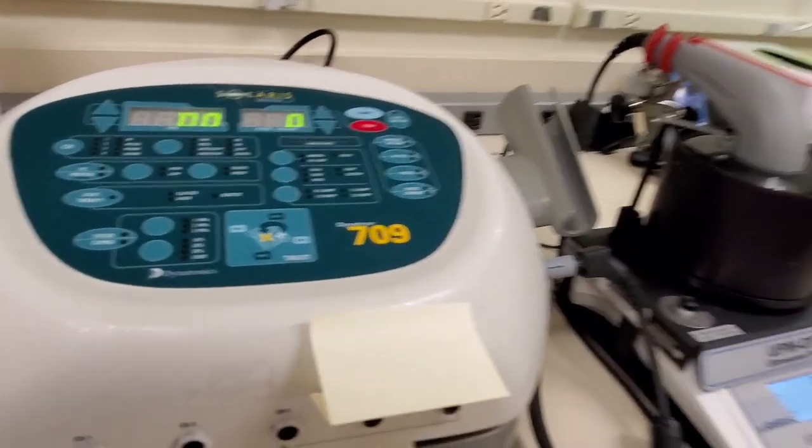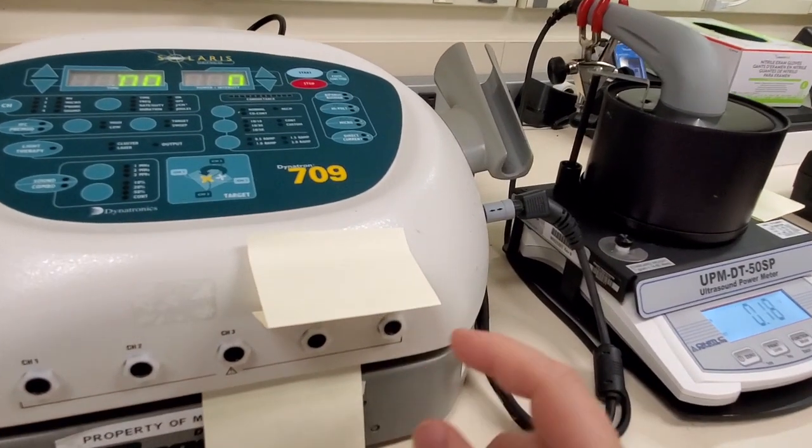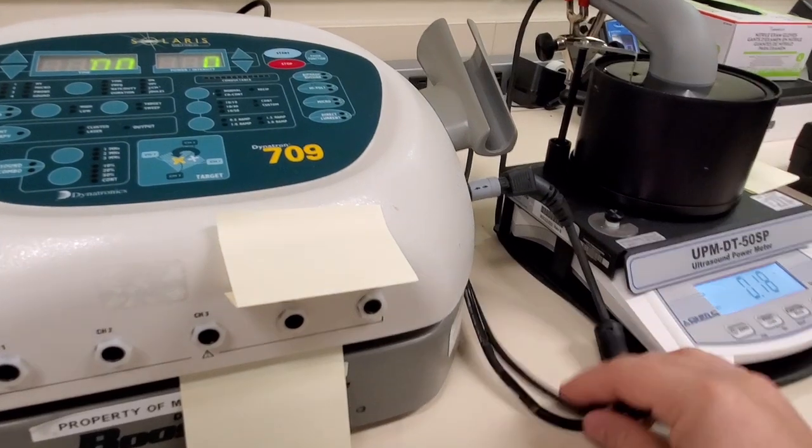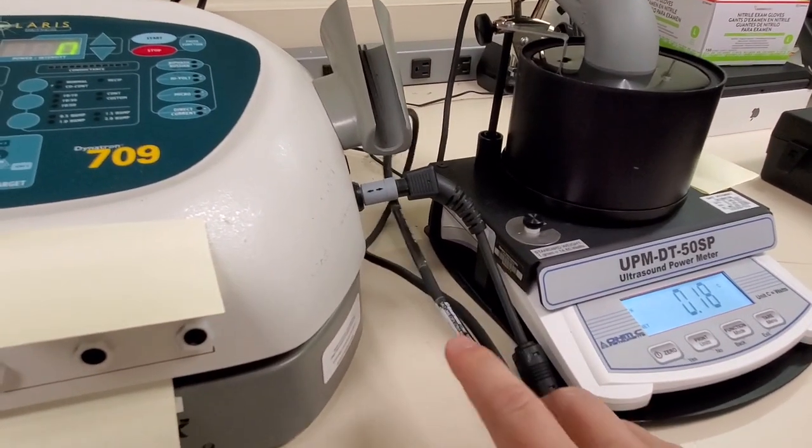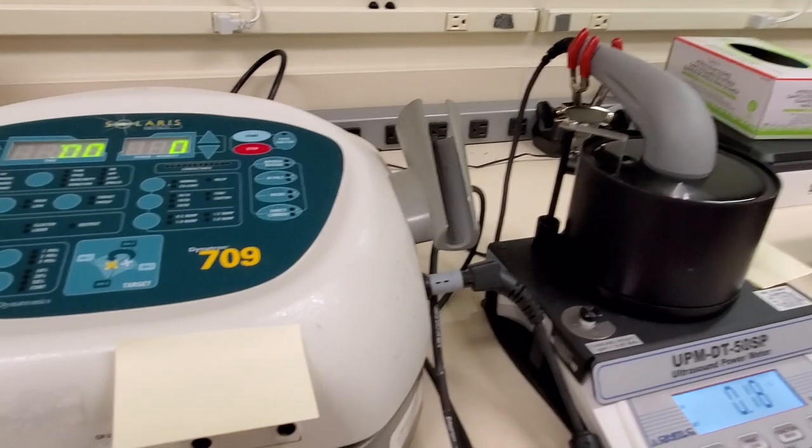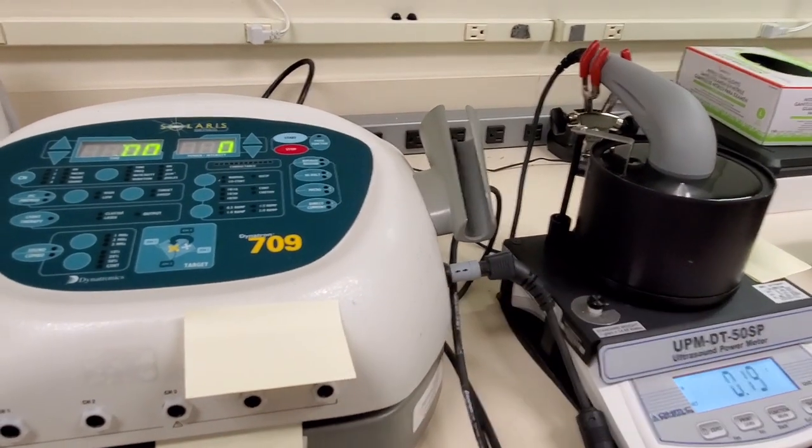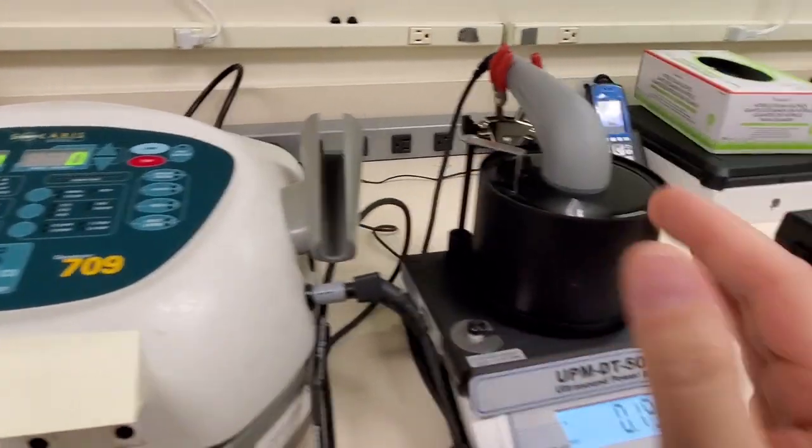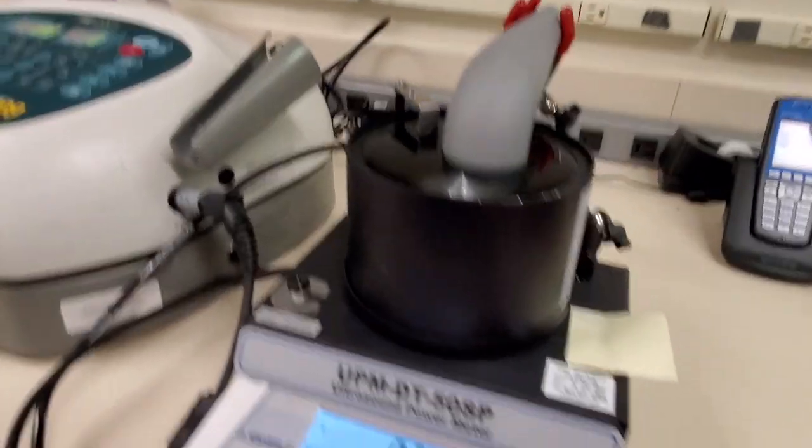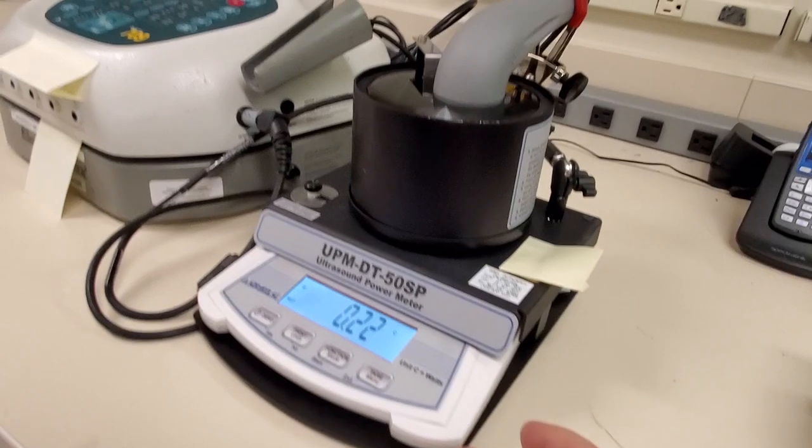And the only way that I can do that at this point is I have to call the manufacturer. This unit right here has got a serial number on the probe - you can see it's on the little sticker - and they will read back to me the settings line for line that I have to put back into the base unit to get the head to begin to work again.